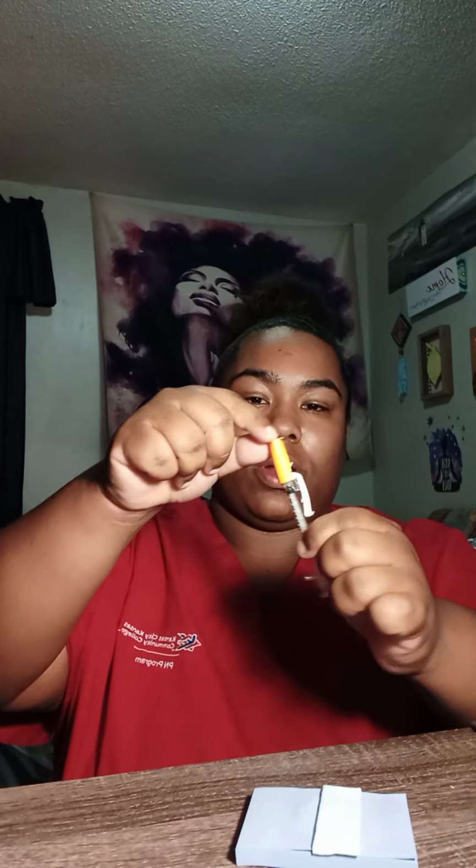I'm going to take this. I'm going to take an alcohol wipe. I'm going to wipe the skin down just to make sure. Do not rub. Then I'm going to go like so. One hand scoop technique. I'm going to try again. Against that. Then I'm going to close it.